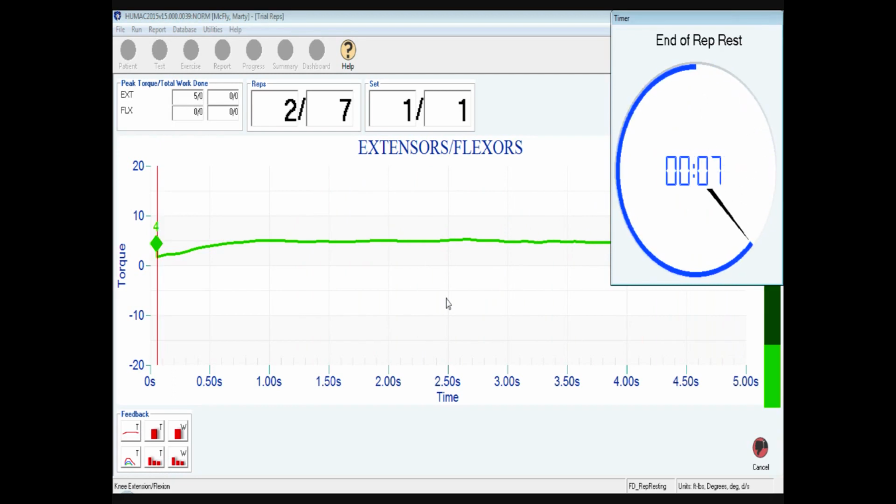After each rep, I ask them how they're doing. Let me pause this here because this is important. I want to make sure that we cover this. All right, after each rep, I ask them how they're feeling with that rep. If they have no pain, great. 25% no pain, let's move on to 50%. 50% no pain, move on to 75. 75 no pain, move on to 100. Fantastic. You're testing them at 100% of their effort.